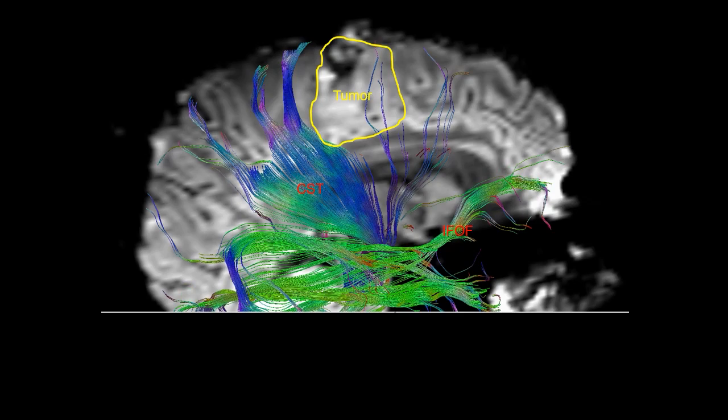This slide illustrates the real utility of DTI in that it can show displacement of large tracts by the tumor, which can assist with preoperative surgical planning.